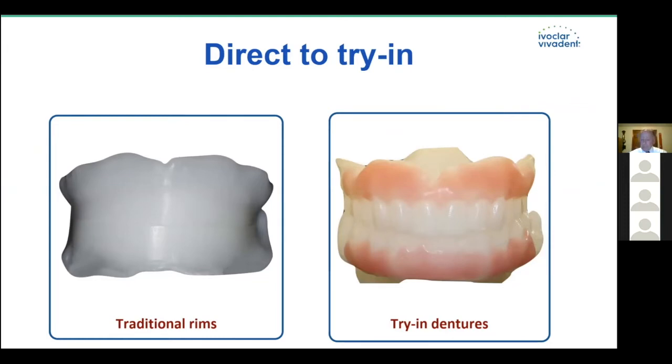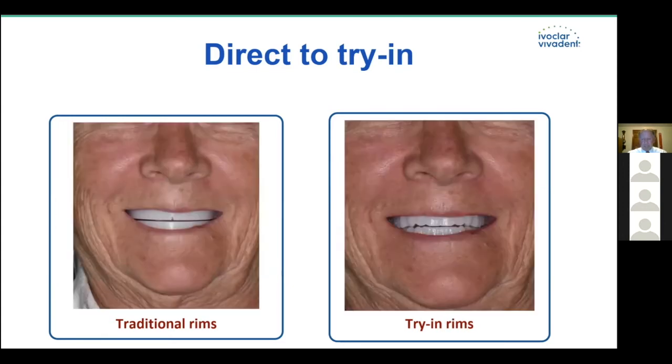And the reason why I'm kind of excited about this is because I think any of us is going to be able to make better judgment on the evaluation of these, because they're shaped like teeth. I could see better. Patient could look at them better. The patients could function, talk with them better as you're testing phonetics and things.